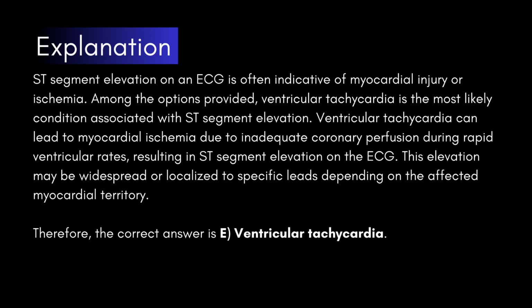ST segment elevation on an ECG is often indicative of myocardial injury or ischemia. Among the options provided, ventricular tachycardia is the most likely condition associated with ST segment elevation. Ventricular tachycardia can lead to myocardial ischemia due to inadequate coronary perfusion during rapid ventricular rates, resulting in ST segment elevation on the ECG. This elevation may be widespread or localized to specific leads depending on the affected myocardial territory. Therefore, the correct answer is E, ventricular tachycardia.